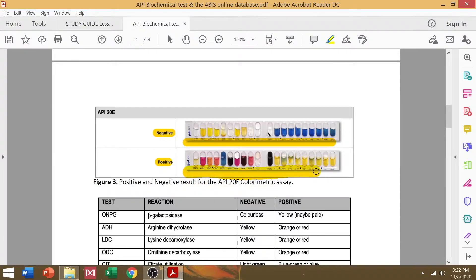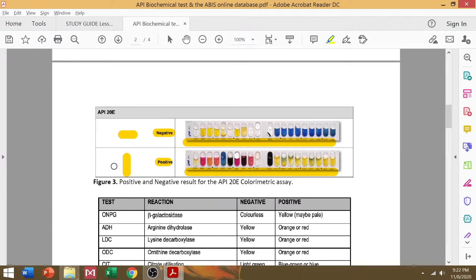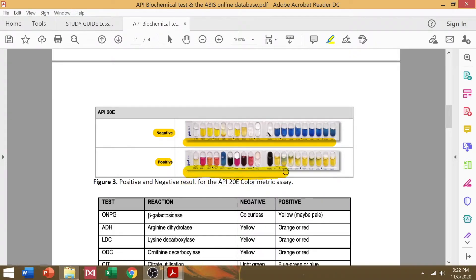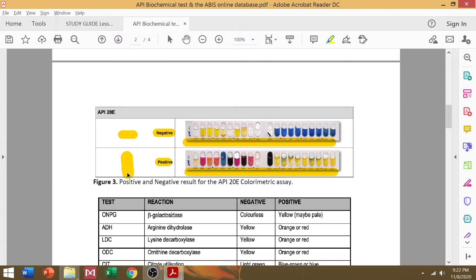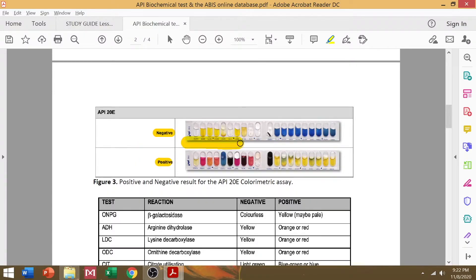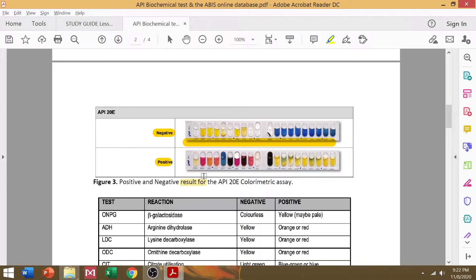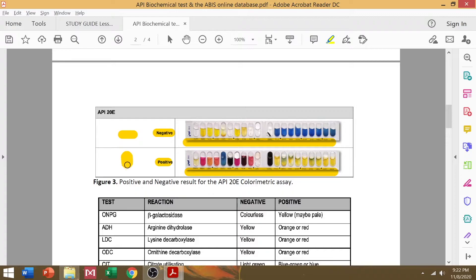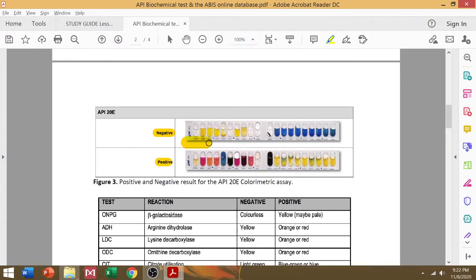So, remember that these chambers will be inoculated with your bacterial isolates, meaning you need to pay attention to the color changes in this chamber. If they have these positive color changes, it means that the bacteria can do that metabolic activity or can perform that metabolic activity in that certain chamber. But if that color change is negative, that means the bacterial isolate that you have cannot perform that glucose or gelatin hydrolysis, that urease activity, certain things like that. So you need to focus on those colorimetric changes.